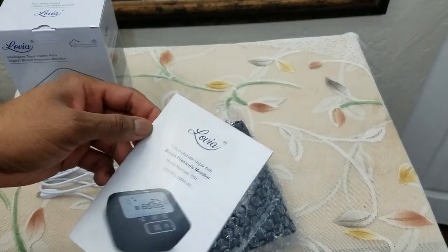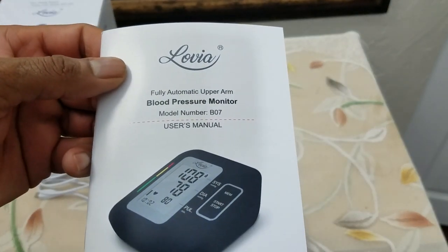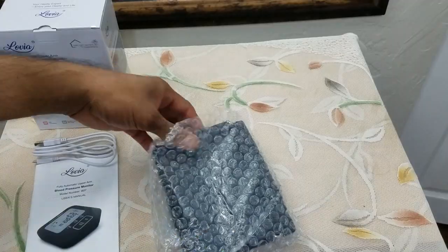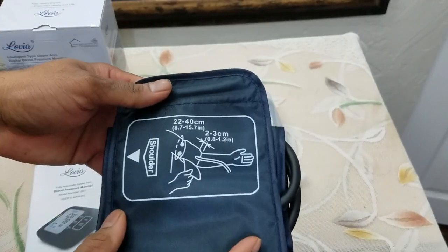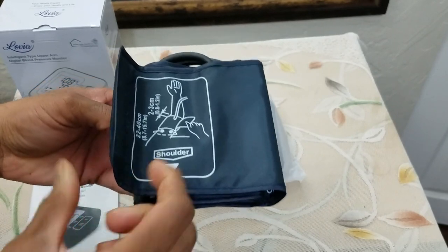It has a pretty thick user manual, and that's the model number of the product — it's Bravo 07. That is the pressure tube, and it shows you the direction, so this is supposed to be facing towards you.